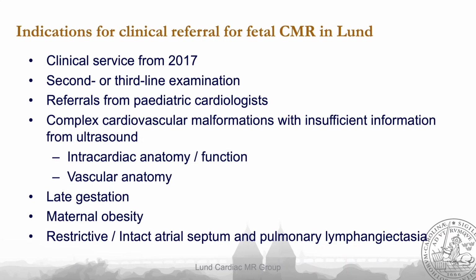We generally run the scans in late gestation and also have quite a few cases with maternal obesity, in relation to the relatively slim pregnant women in Sweden. And then we also have the very specific question about restrictive intact atrial septum and pulmonary lymphangiectasia particularly.